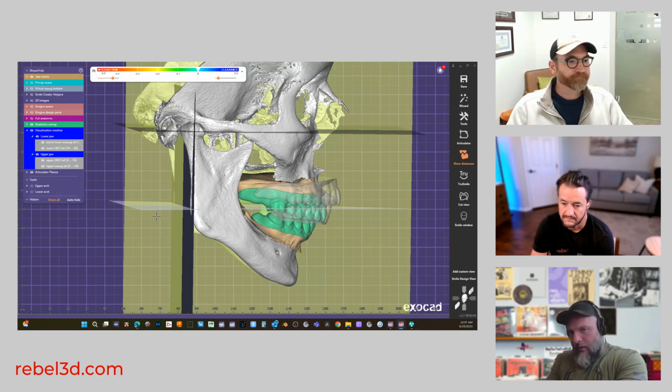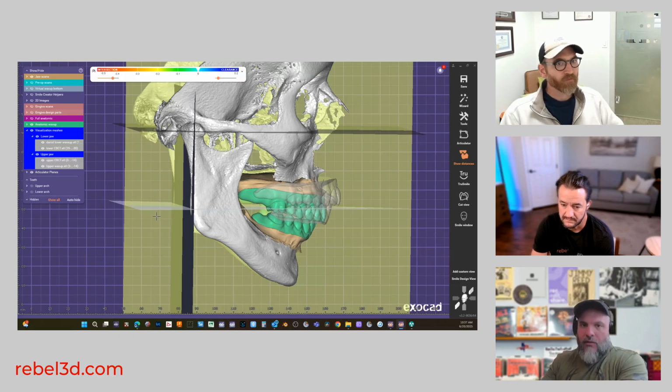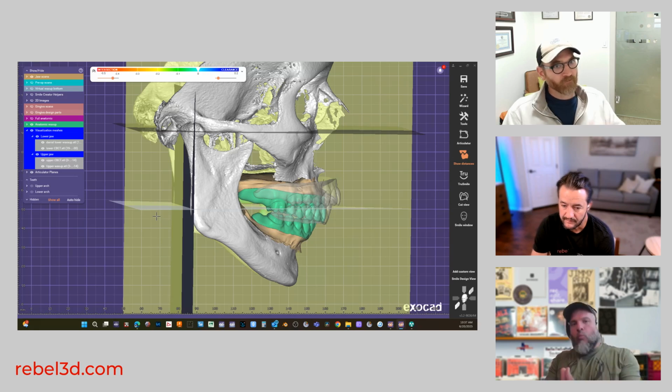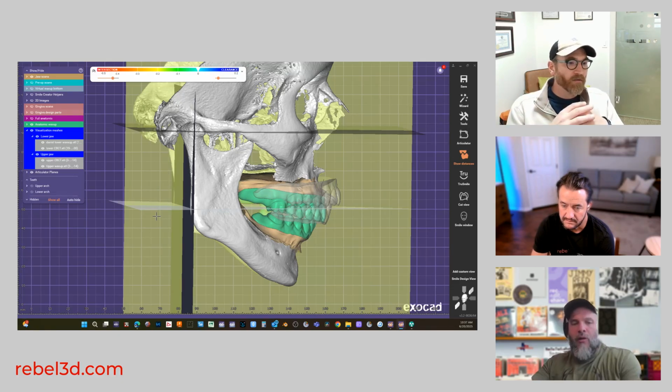And then the whole relationship gets strained between doctor and patient, and also doctor and lab, because of the problems that this is going to create. From a designer standpoint, I understand Dr. Sven has got to look at the anatomy of the patient, but I look at it as a relationship problem. We're shoving a wedge here that is going to cause strain down the road. So that's what I'm looking out for.